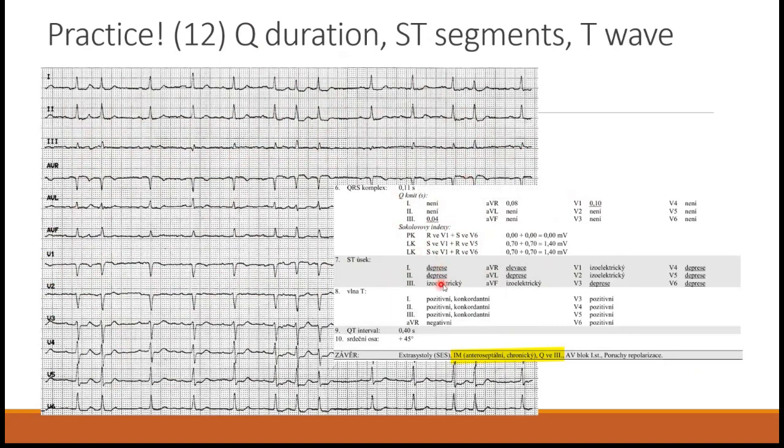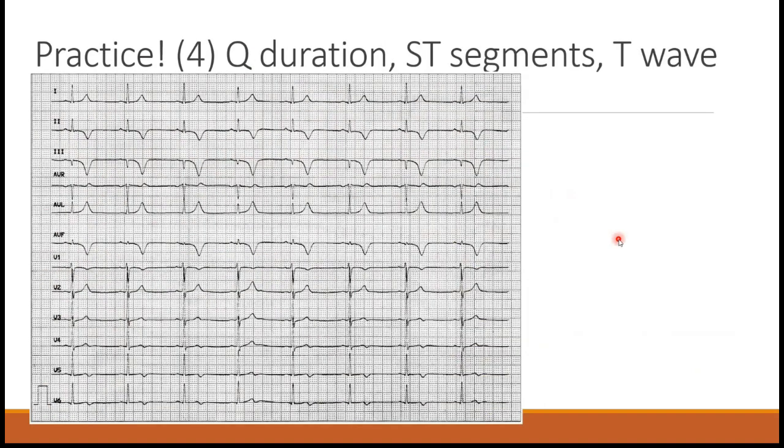And of course, because we have depressions, we have to mention that there is repolarization disorder. Here's the next question.